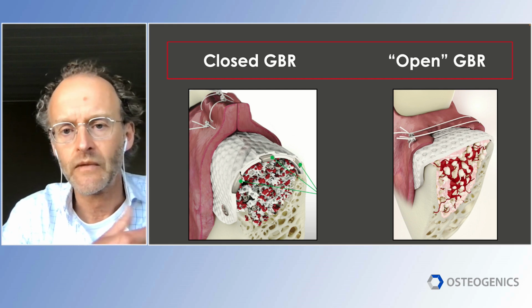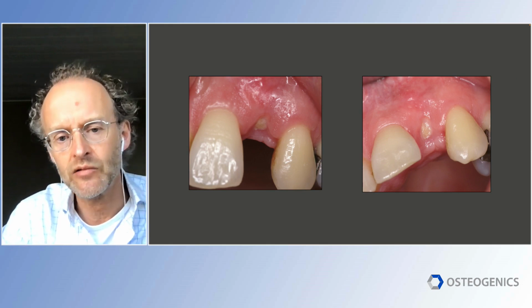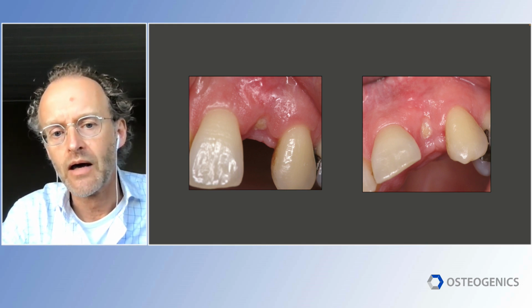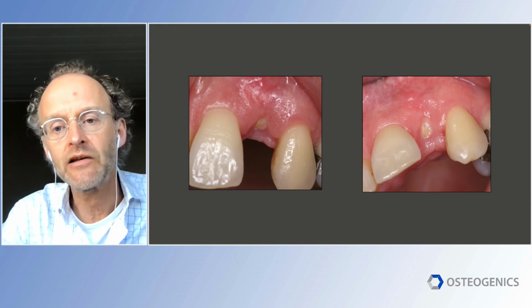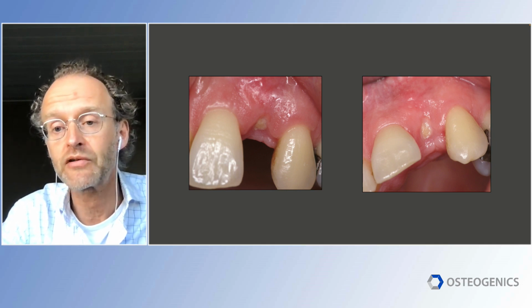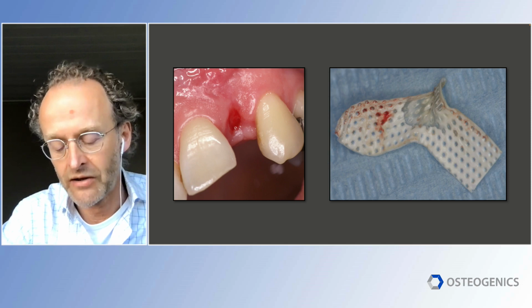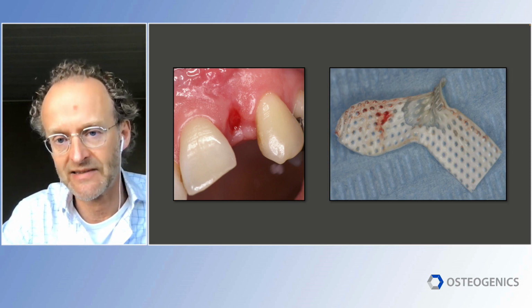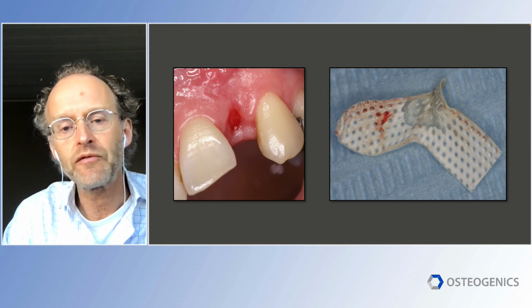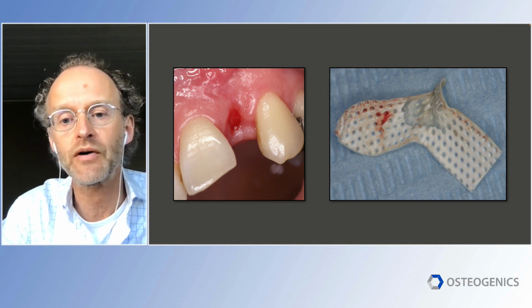But we got interested, and we started ordering this membrane and treated first small cases. Cases like this, tooth taken out, membrane placed, and here you see the clinical view after 4 weeks. And the tissues really look at ease. There's a little bit of plaque on the membrane, but that doesn't matter, as we know it's non-permeable to bacteria. At that time, 4 weeks after extraction, we can take out the membrane. A nice property of the membrane is that it doesn't easily tear. It stretches more. But if you want to take it out, you will feel that the tissues have some grip on the Regentex surface, so you have to apply a little bit of force. Don't be surprised by that.